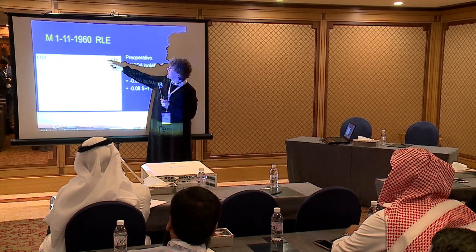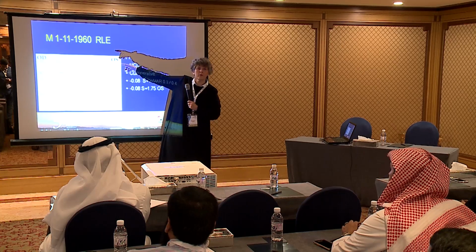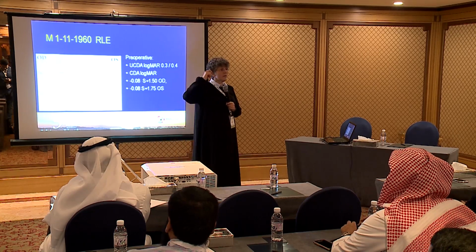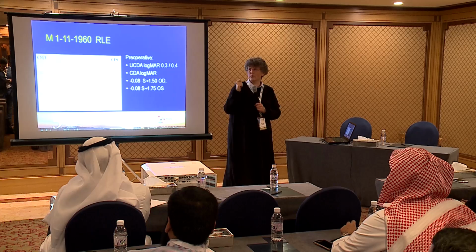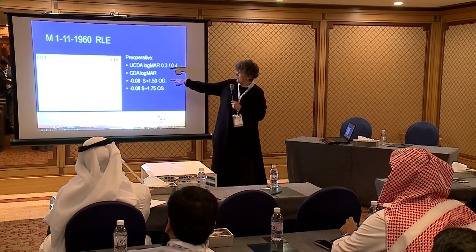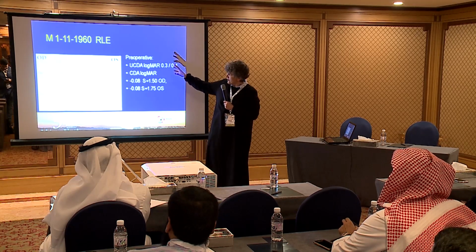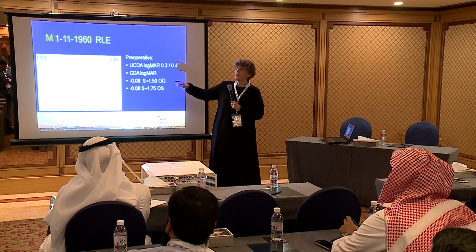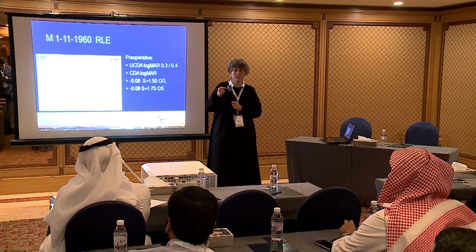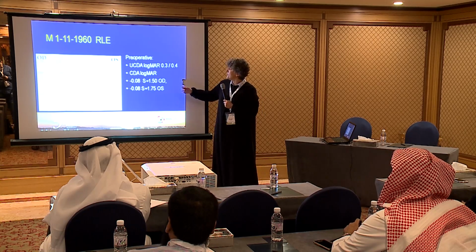cylinder, but his cornea is quite flat. It's 39.7, 40.5. This is a flat cornea. It's under 42. And this will give you an odd result. And that's why I put a sign through the SRKT. I'm not going to do that. And I went to the Hofer Q because of the flat corneas, because it's relatively short because of the cornea.